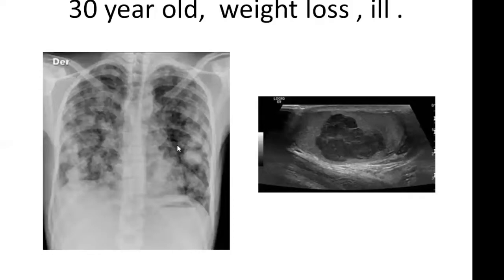You have a chest x-ray here in a young person. It's an unusual tumor, could be lymphoma, melanoma, or testicular, and ultrasound can help you. These may not be palpable, but you can see them with ultrasound.